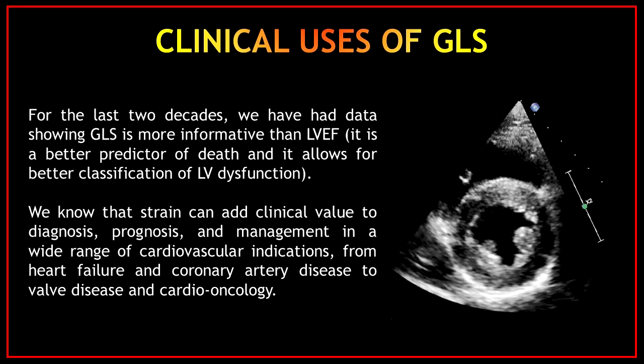What are the clinical uses of global longitudinal strain? For the last 2 decades, we have had data showing that GLS is more informative than left ventricular ejection fraction. It is a better predictor of death, and it allows for better classification of left ventricular dysfunction.